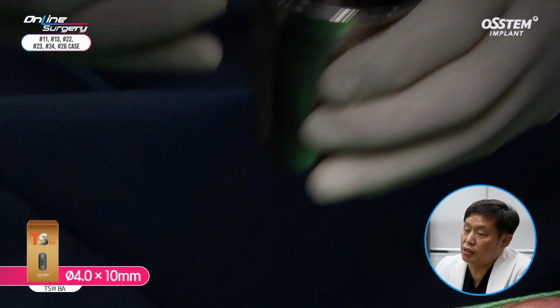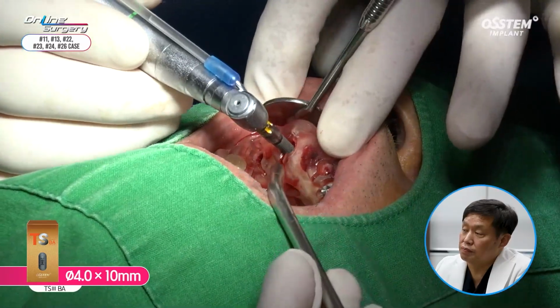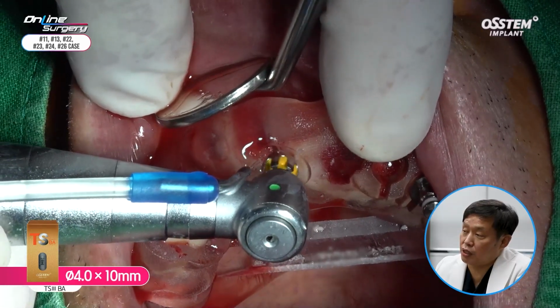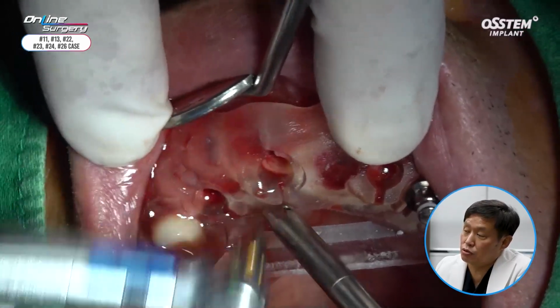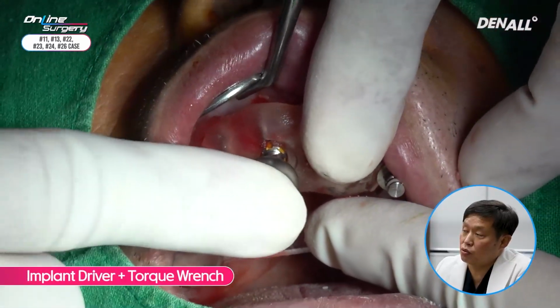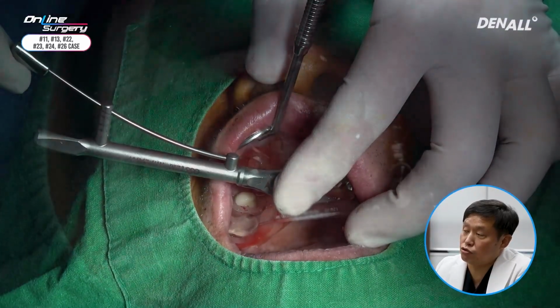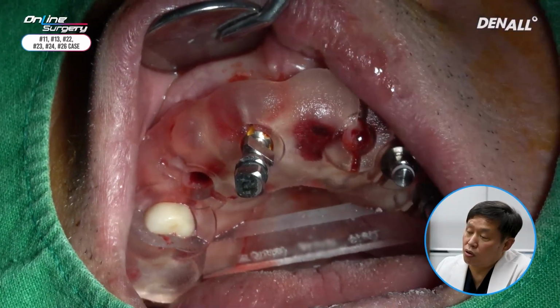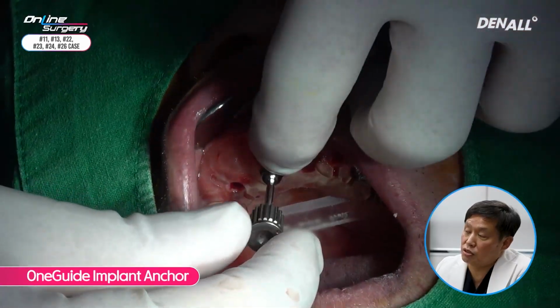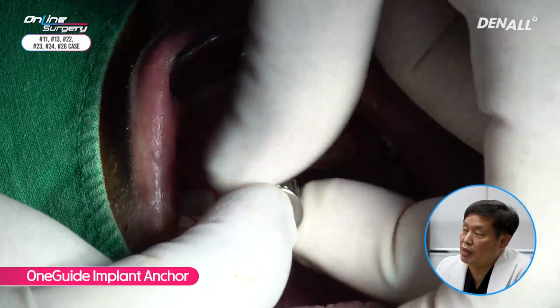In number 11, a 4.0 by 10 mm TS3 implant was placed. Because there were 2 vertical anchors on the left and a tooth on the right, the template was fixated for sure, and the implant driver and torque wrench were used to adjust the final depths and position the hex. Primary stability was sufficient. In number 11, the OneGuide implant anchor was connected. In this clip, I wanted to emphasize the use of vertical anchors, so I used them as much as possible.